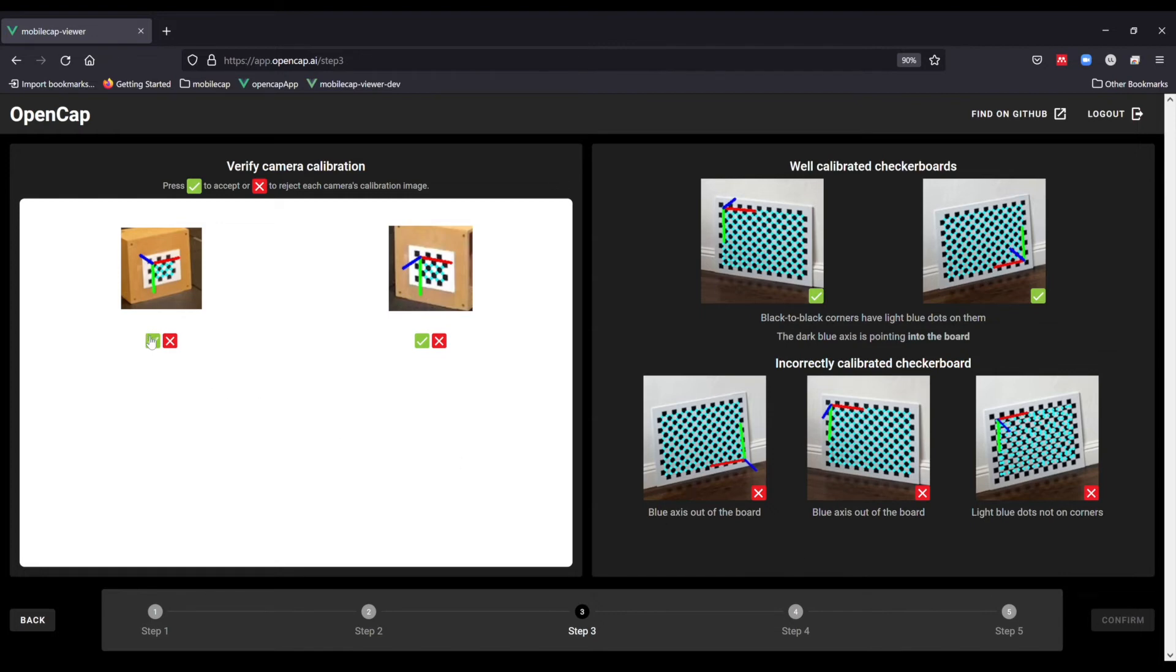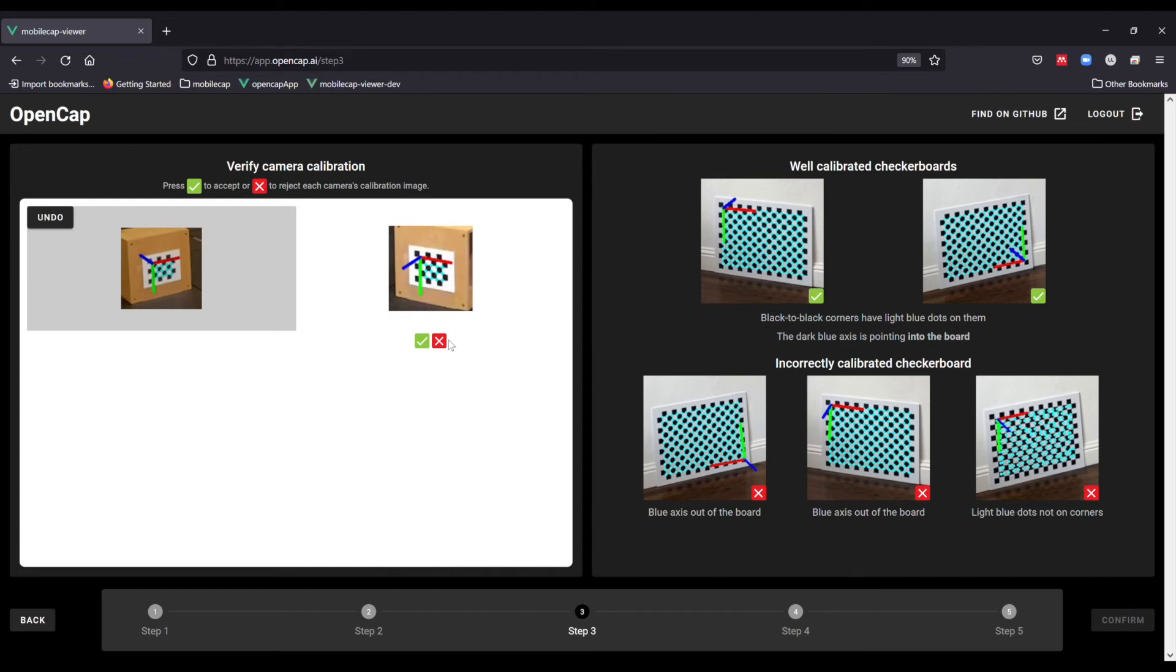You can press the green check mark to accept this calibration. The second image appears to have the axis pointing out of the board, so you would press the red X. If the correct image appears at this point, then you can press the green check and confirm the entire calibration.